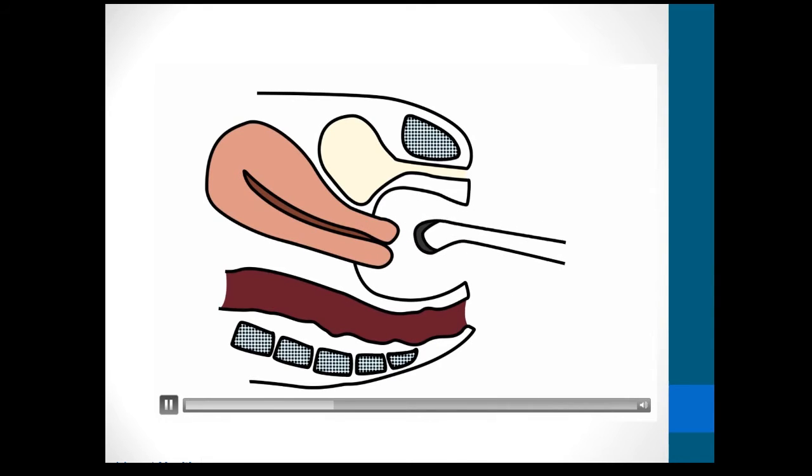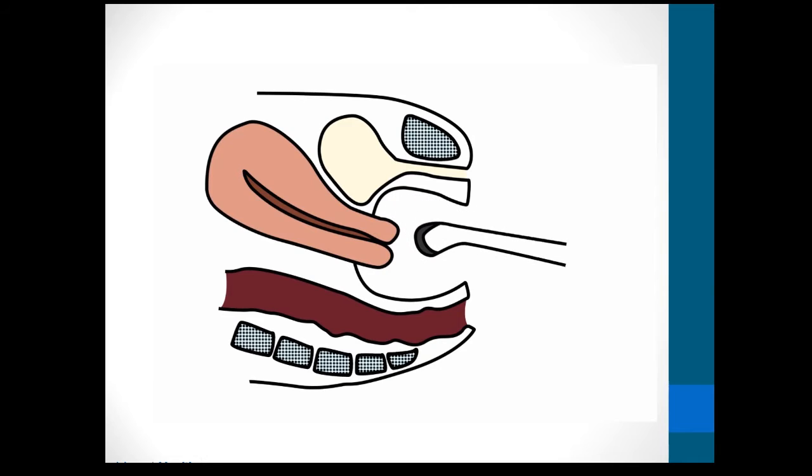To assess the pouch of Douglas, this maneuver is probably the most important one to remember. When we do an ultrasound, very often we will put the probe in the anterior fornix, and we look at the uterus, we look at both ovaries, and then the scan is considered done and the probe is removed. Whilst if at the end you put the probe in the posterior fornix, then you have a chance of seeing all the pathology that may occur in the pouch of Douglas.